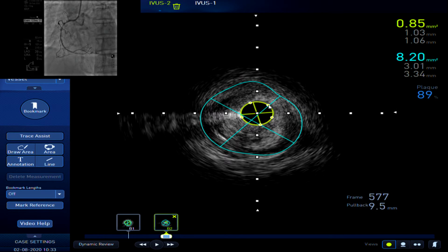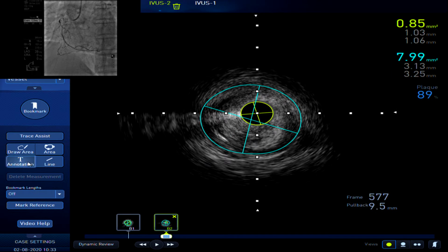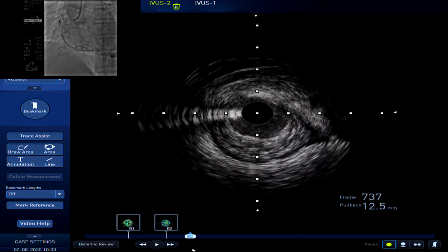So Dr. Saito, even though your wire is in subintimal, would you change your strategy? No, it will not be a problem. It's a short segment, so I don't care. You don't care? How long do you care? 3.48. Yes.